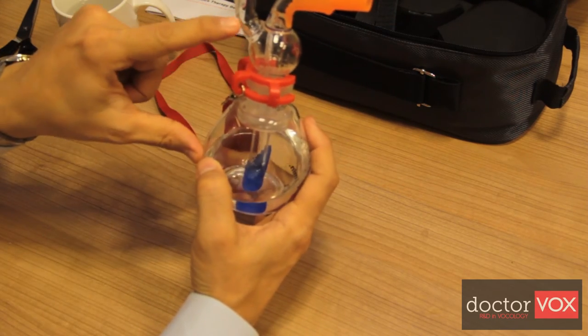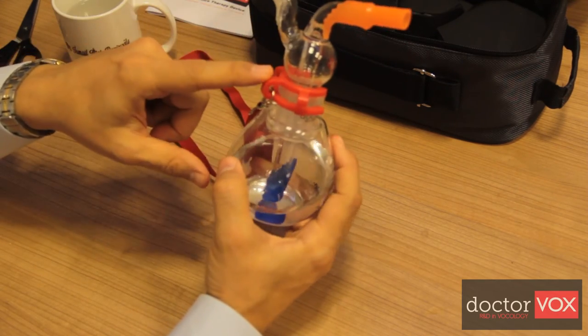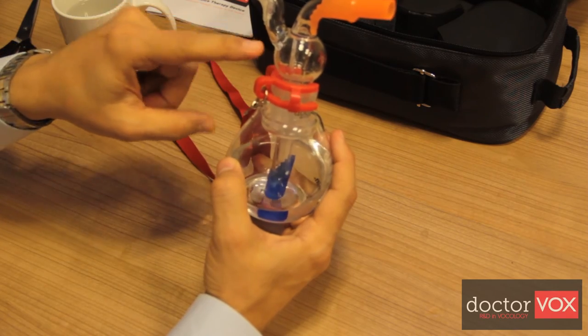Additionally, the swan neck shape of the breathing outlet helps prevent water spillage.